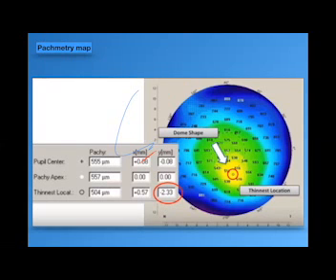490, this is the school I'm following. Other authors are saying that the cutoff point is 500 micrometer. Don't go for refractive surgery or flap-containing refractive surgeries if the thinnest location is less than 500 micron. But I'm supporting the view that we can go for refractive surgery if the thinnest location is 490, provided that all figures are okay.